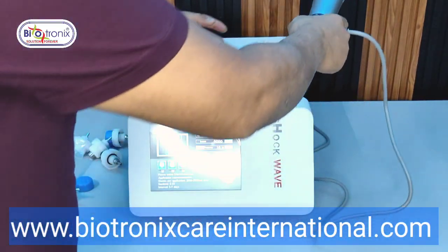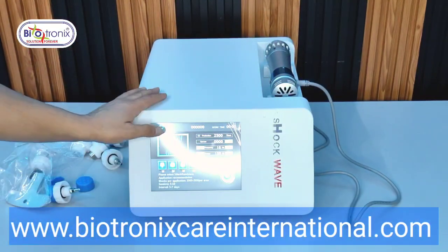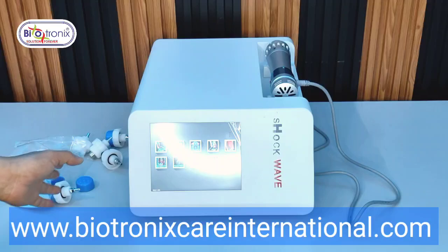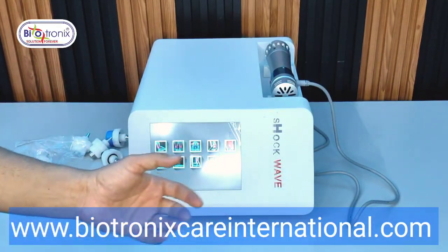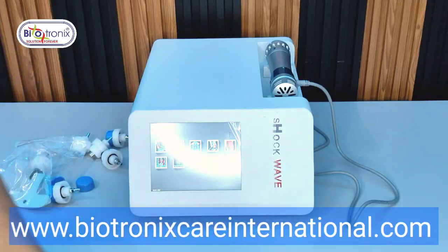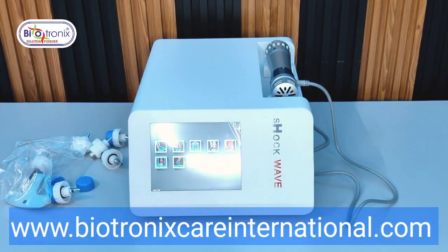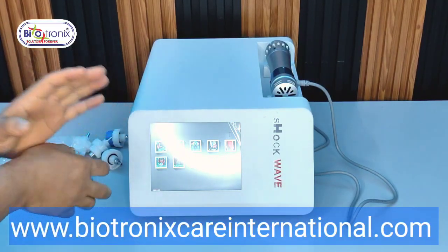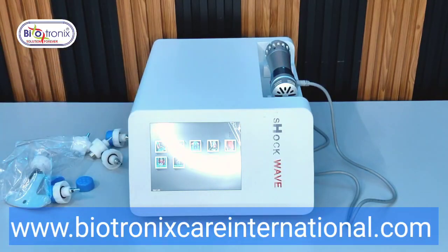So this was a demo of the device. I think I have explained everything. Nothing left. Let me summarize also. 8 programs for physiotherapy, 1 for ED, 1 for fat accumulation slimming. The maximum intensity you can put depends on the joint you are using, and you can vary the intensity. Recommendations are there, everything recommended is there, handpiece also. But if you want to vary it, you can change within the limits.